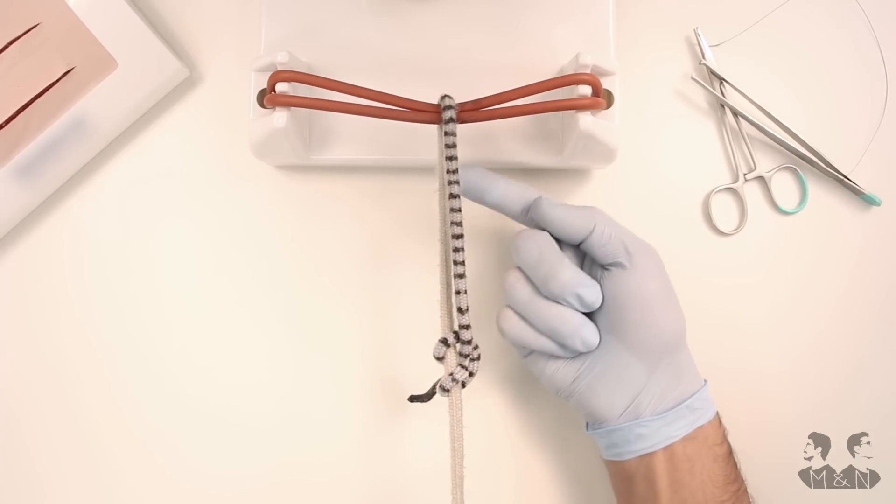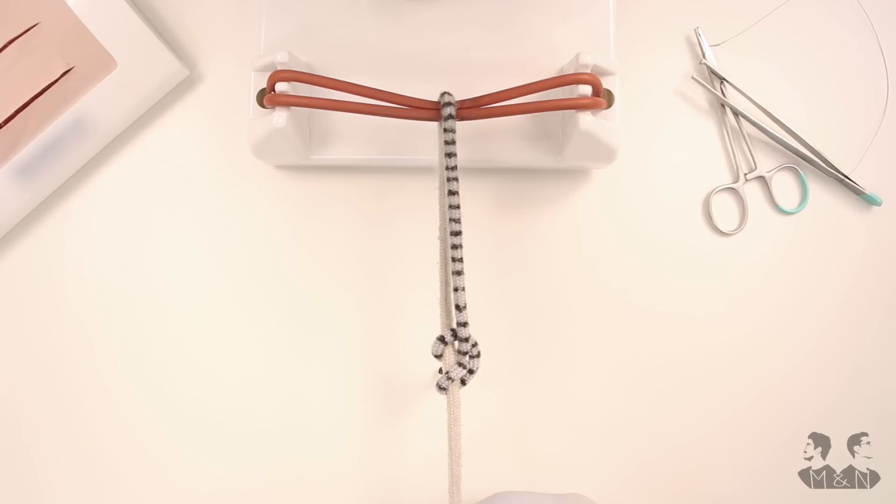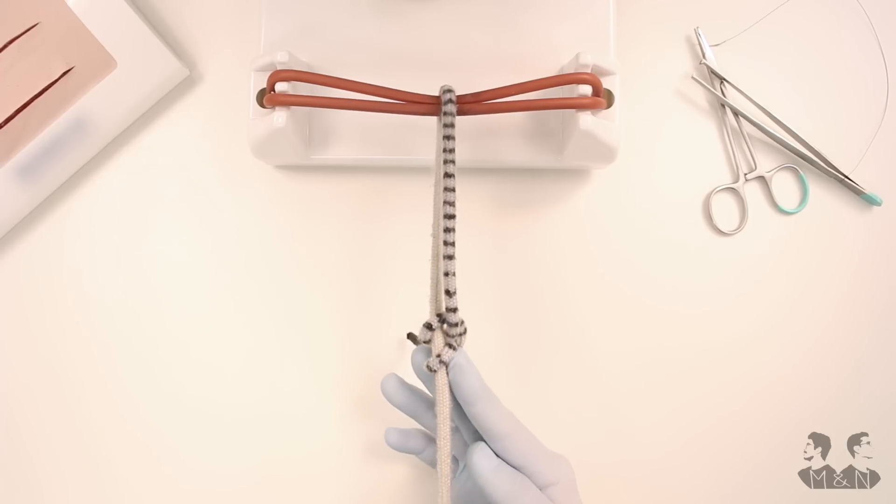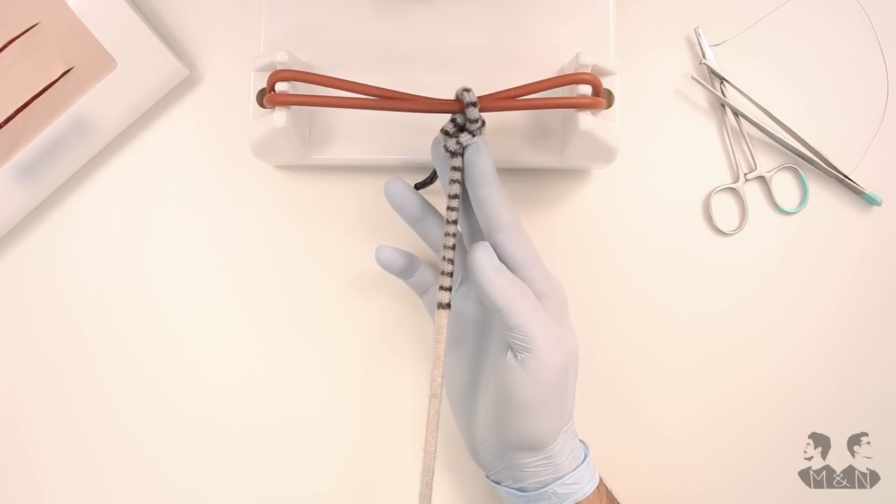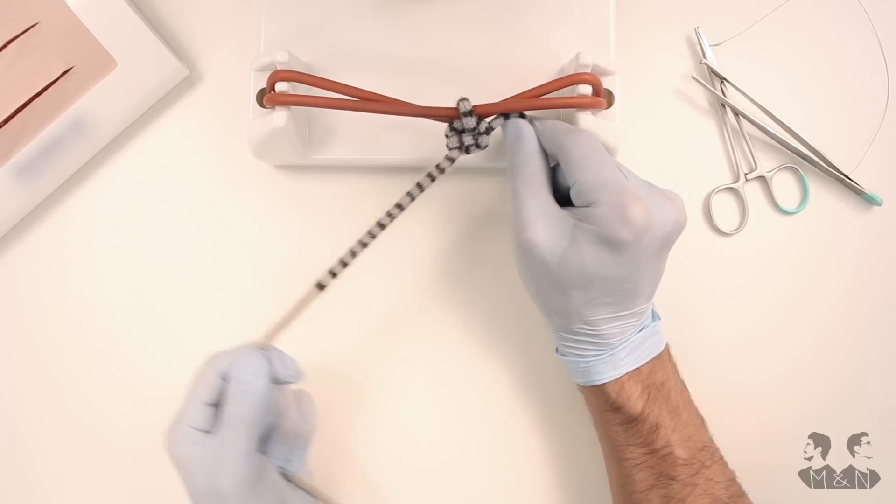By examining the knot you can see that the wide end draws a continuous line through the knot. This is why it is possible to push the knot into the depth of the wound and fix it there. After that you would lock it into position by at least one square knot.